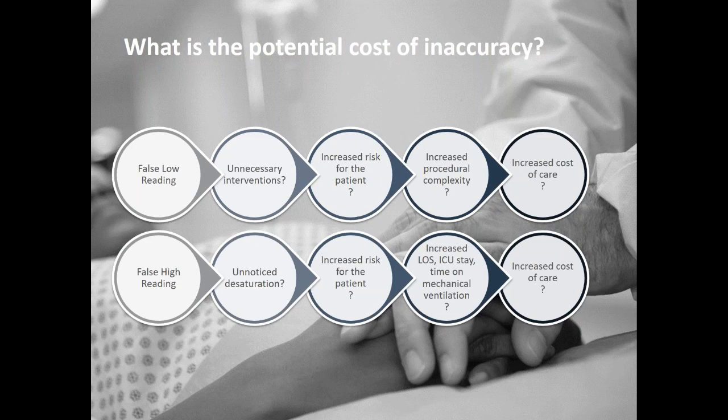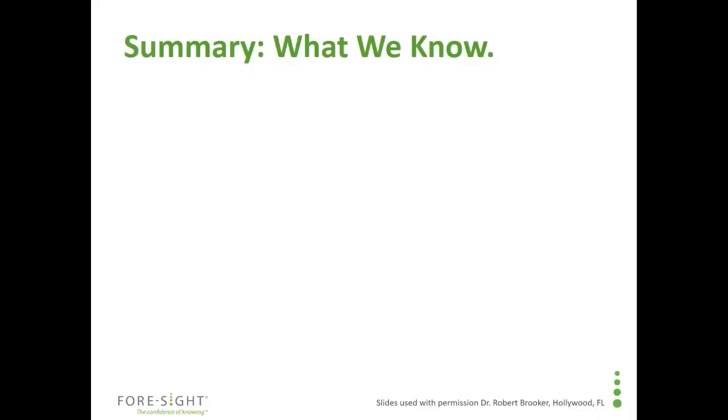And just to review that the CASMED device, for those of you that are not familiar with it, provides a high level of precision, because it's using 5 wavelengths of light to deal with all the confounders that are present in cerebral oximetry, and there are multiple. And if you don't adequately deal with the confounders, and those would be things like scalp blood flow, the effects of the bone in the head, and so on, then the information the device gives you is not going to make sense. So again, relative to oximetry and using it clinically, the CASMED system is really one of the best. So to summarize then, what do we know?